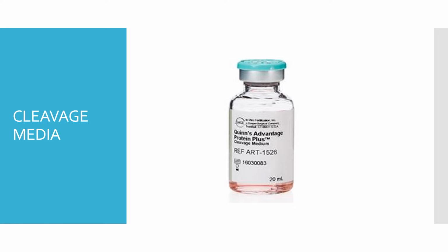Basically, carbohydrate in the form of glucose: in the early embryo it shows a simplistic physiology and maintains only low levels of oxidative metabolism, whereas after compaction the embryo utilizes a wider spectrum of nutrients, with biosynthetic rates increasing along with an increased respiratory capacity and an ability to utilize glucose. Glucose is also metabolized by the pentose phosphate pathway, which generates ribose moieties required for nucleic acid synthesis.